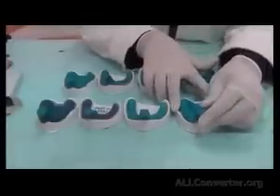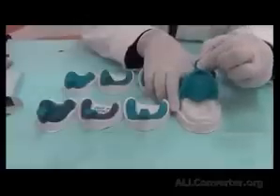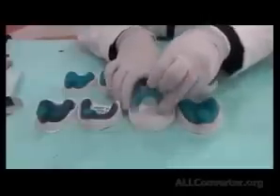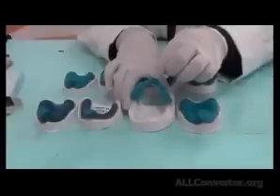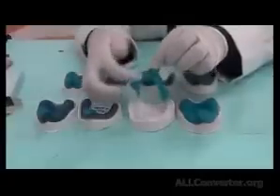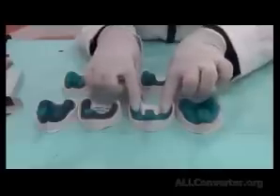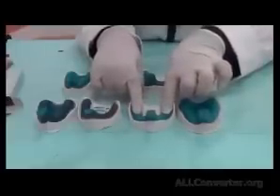The technician might have made the special tray without any spacer. And if we're going to take a secondary impression without any spacer, this means the tray is closely in fit with the tissue. So once we load it with impression material, the material will be squeezed between the solid tray and the tissue. So when I'm taking an impression, it will be said that this impression is tissue compressive.